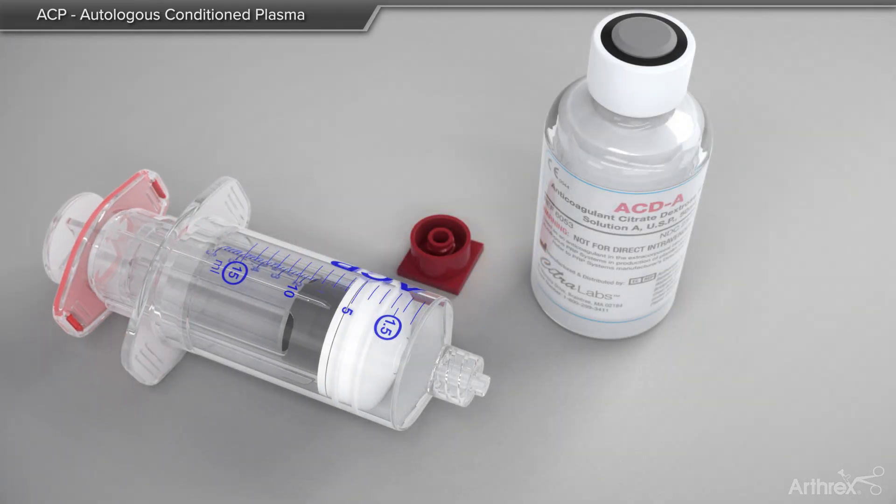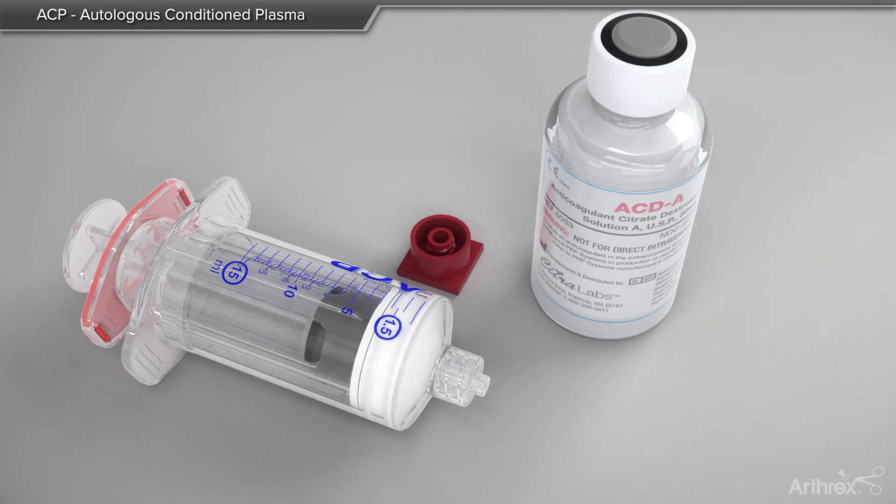Prior to beginning the process, it is best to break the seal of the two syringes, as shown.